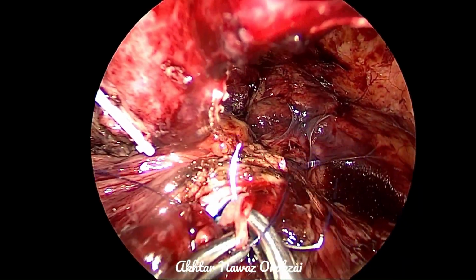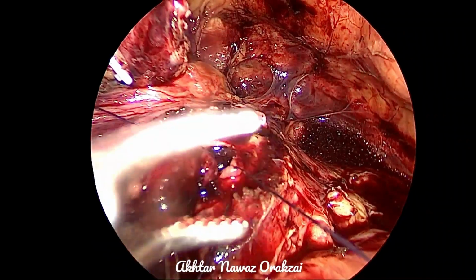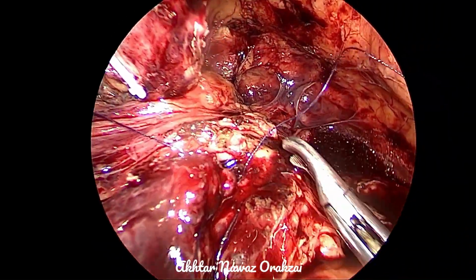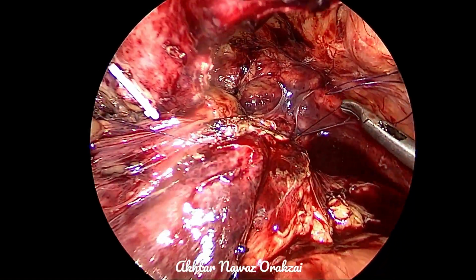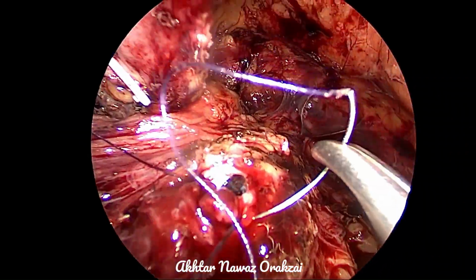The suturing must be completed under vision, not to take the stent in the stitch. The suture must be tightened to ensure watertightness.